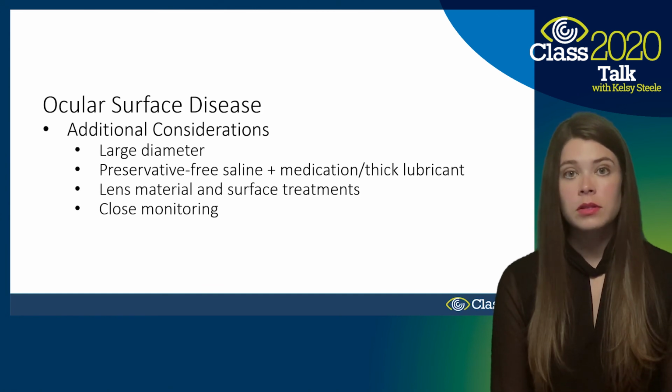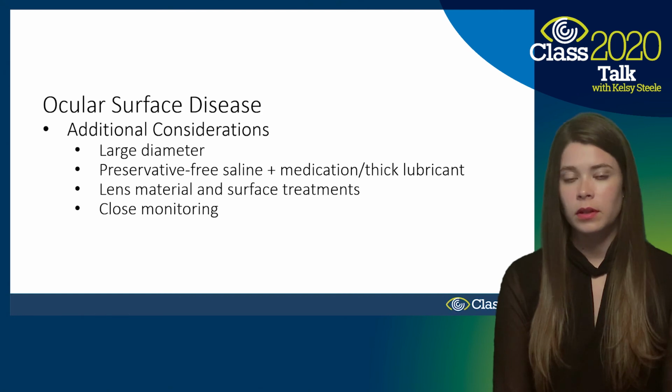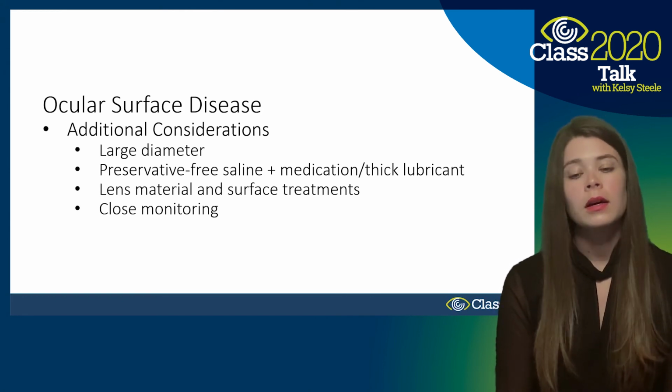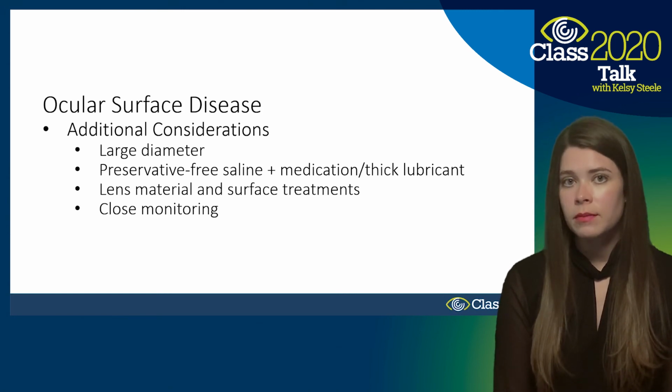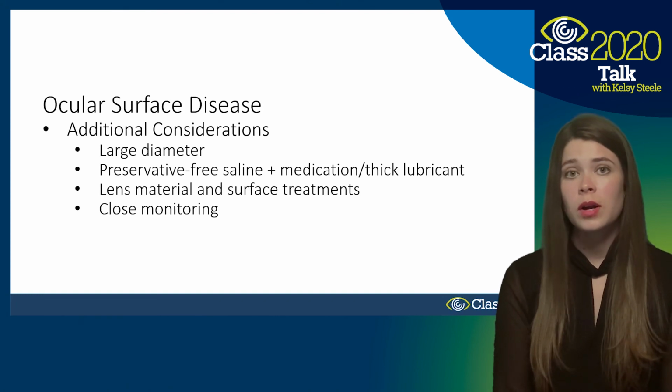Preservative-free saline. So you really want to be careful what you're talking to your patient about as far as filling the bowl. These patients already have inflamed and angry eyes, corneas that are ripe for infection. So you want to make sure they understand preservative-free only, unless you're adding something, like I said, the preservative-free antibiotic. Some of these patients may have a thicker preservative-free drop, like Celluvisc or something like that.